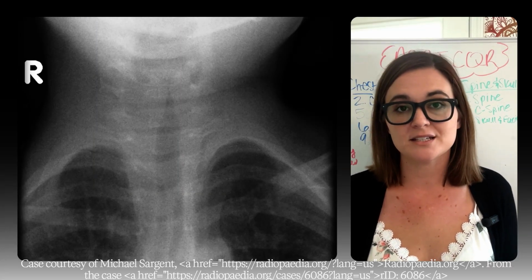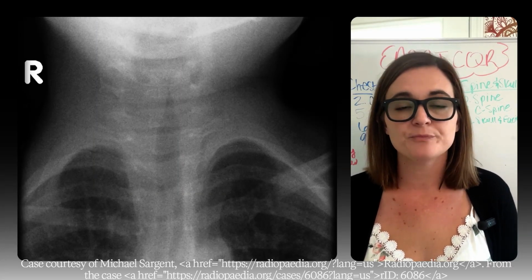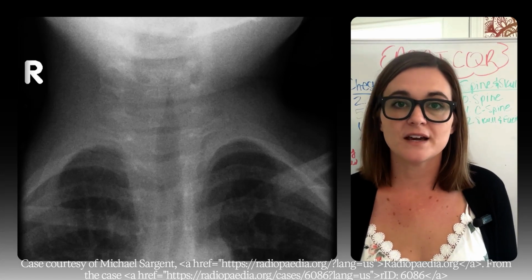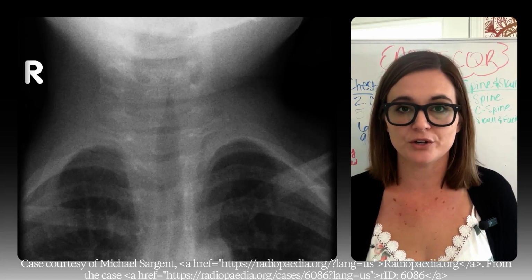But for many kids, especially if it's their first time with stridor, a soft tissue neck x-ray can confirm the diagnosis. That's why this study is such an important one to learn.